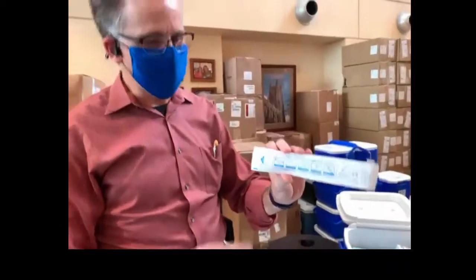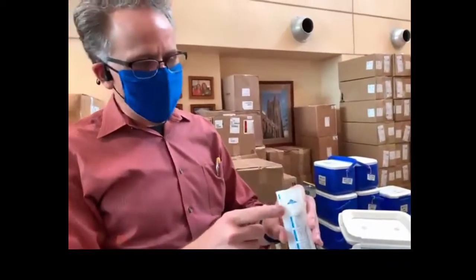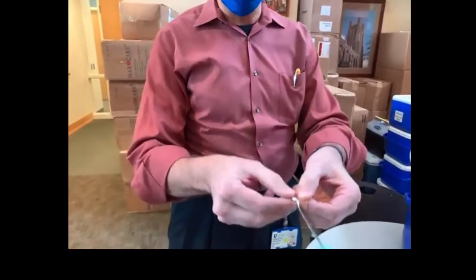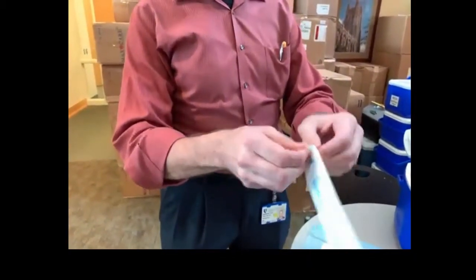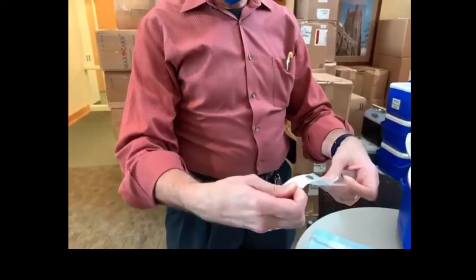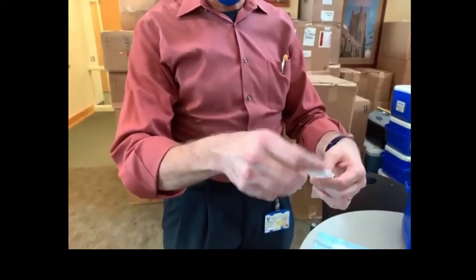This is what the swab looks like. You'll see that on one end it has a little arrow that says 'open' on it, and on that end the plastic is actually slightly separated from the paper so that you can peel the plastic back to open up the swab. This is no different than opening up a band-aid.